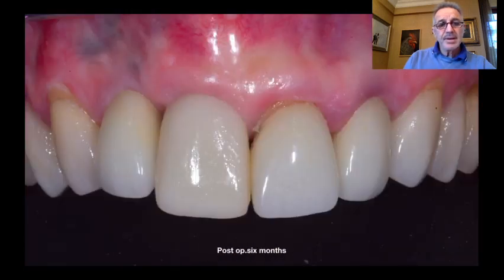As you can see here, we lost some amount of papilla, but this is acceptable. Usually, when two implants come next to each other, I explain the situation to the patient. Even if you obey the rules in the aesthetic zone, you know that you are going to lose some amount of papilla in this area.